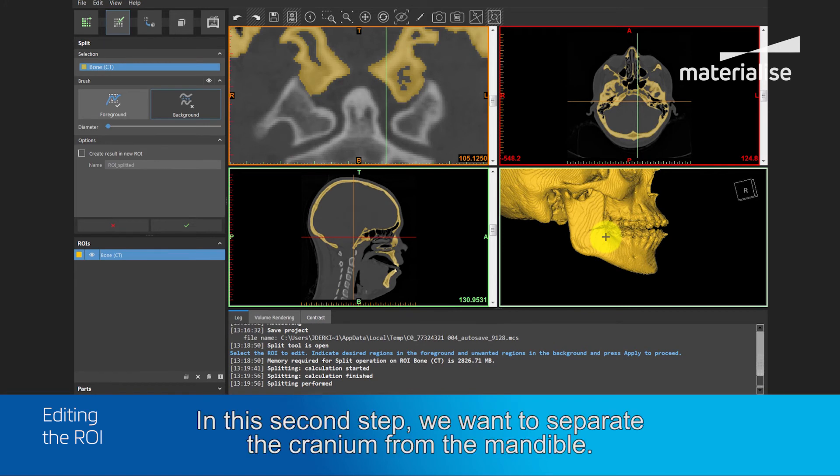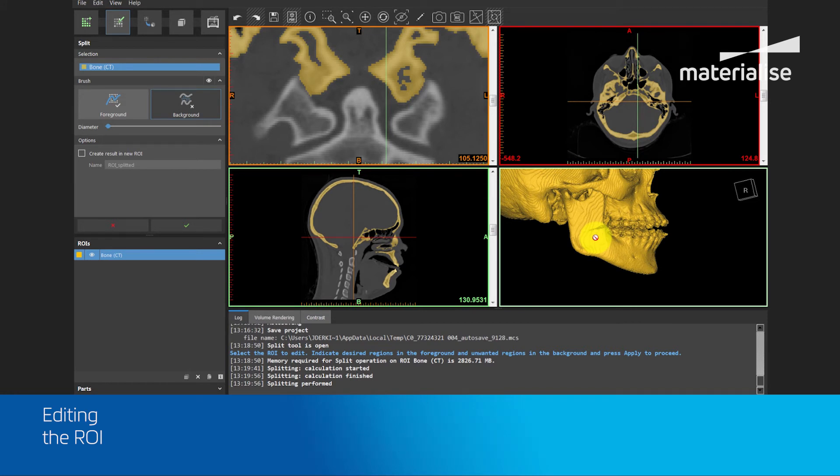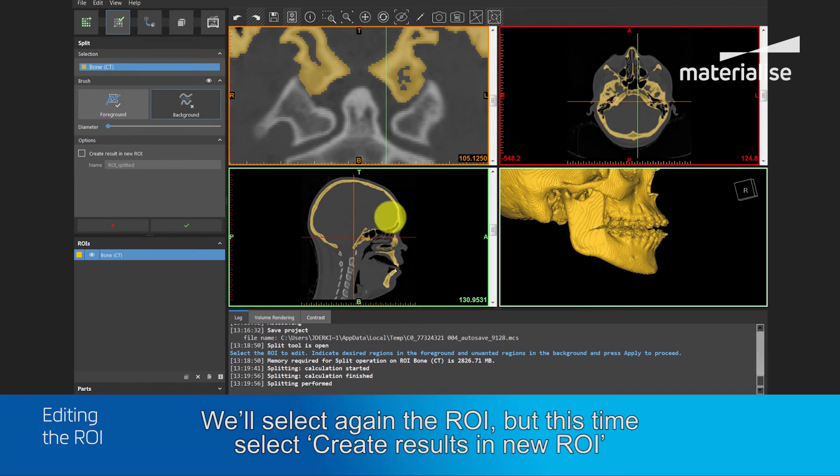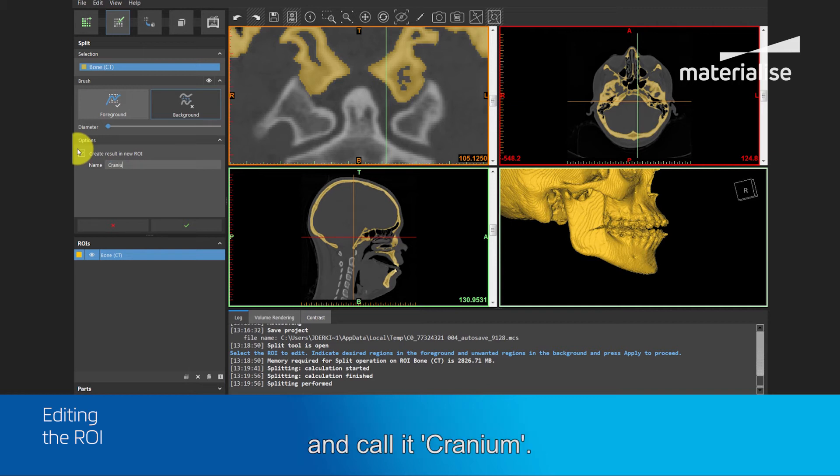In this second step, we want to separate the cranium from the mandible. This we will also do by using the split tool. We will select again the region of interest. But this time we will select create result in new region of interest and call it cranium.